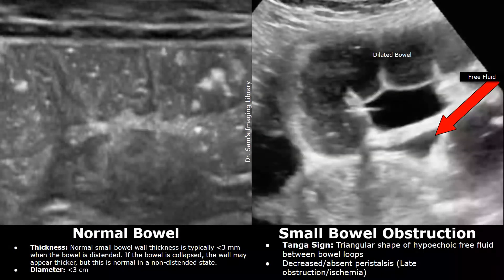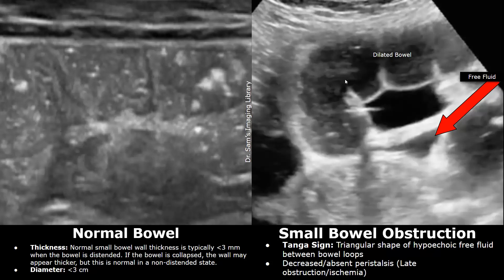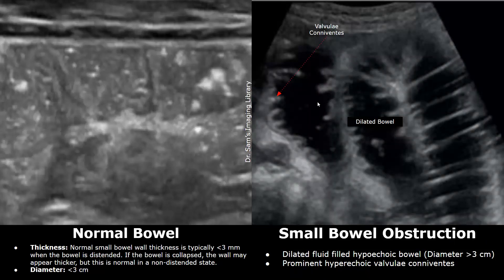This is another case showing the tanga sign — you can see a triangular fluid collection between bowel loops. The bowel loops are dilated and appear hypoechoic with prominent hyperechoic intestinal folds. Peristalsis was absent in this case.